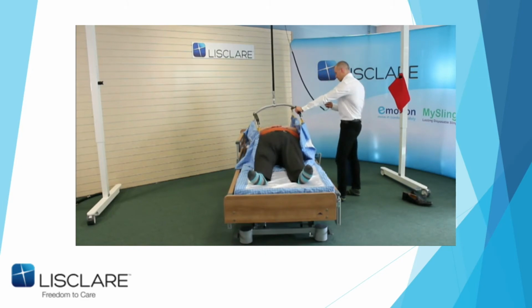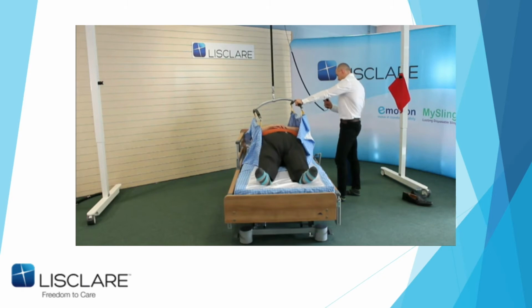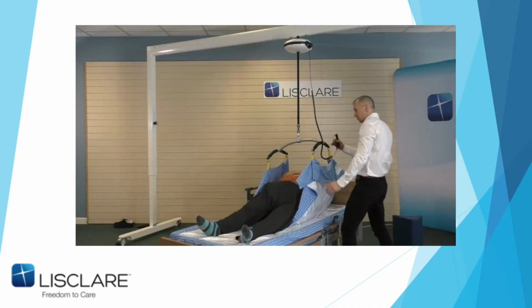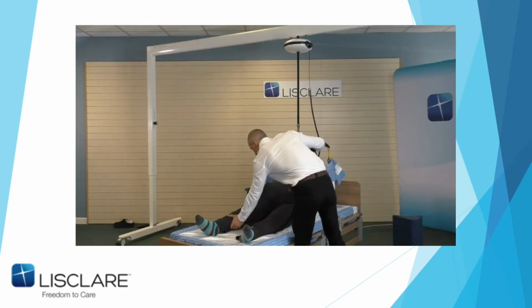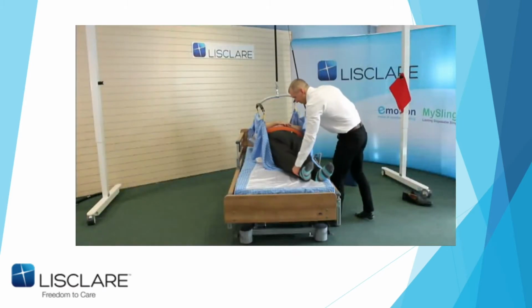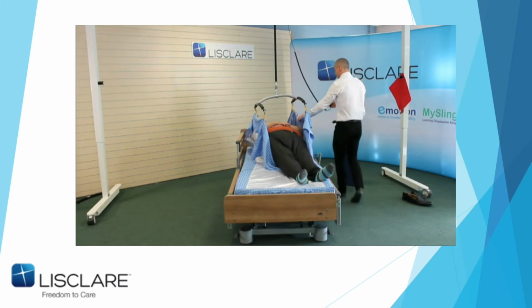Because all he needs to achieve here is just take my weight. That's you, John. Take it up a wee bit more. That's enough. He needs to move my legs across first, just gently, one at a time. All the way, John. That way. Towards you. Try to be on the right. There you go. And then basically lift me up a wee bit more.